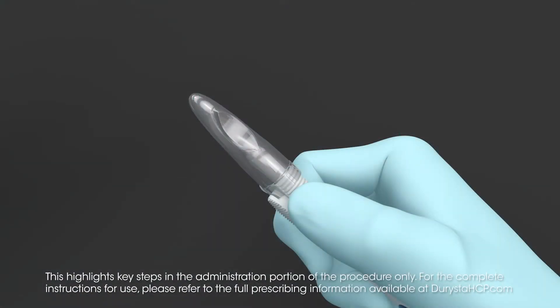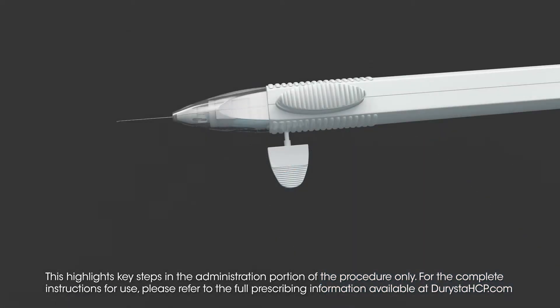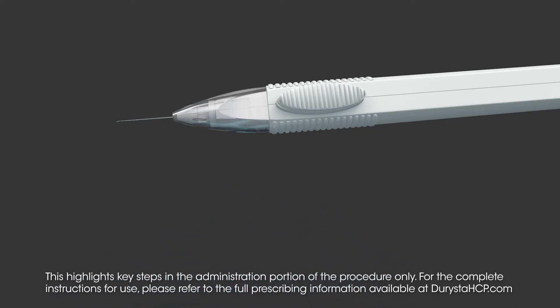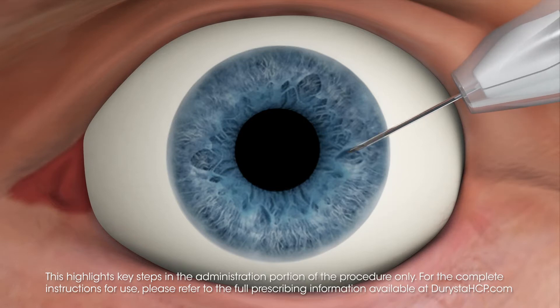When administering Darista, remove the cap. Avoid contacting the needle tip with the cap. Inspect the needle tip for damage. Remove the safety tab by pulling it out perpendicular to the long axis of the applicator; do not bend or twist the tab. Stabilize the eye as the needle is advanced through the cornea. Enter the anterior chamber with the needle bevel visible through clear cornea, entering parallel to the iris plane, adjacent to the limbus through clear cornea in the superotemporal quadrant. Insert the needle approximately two bevel lengths with the bevel completely within the anterior chamber.